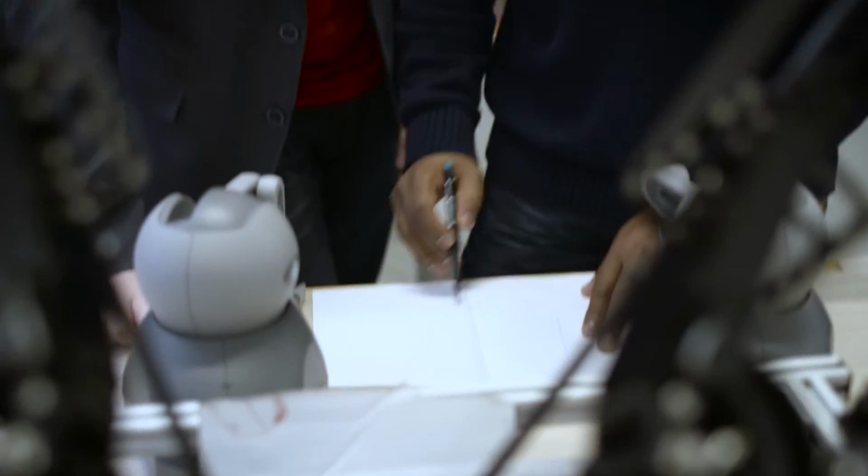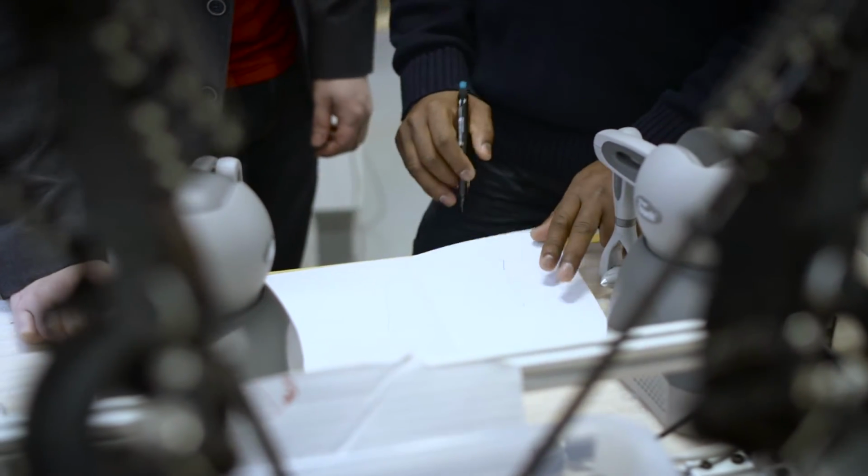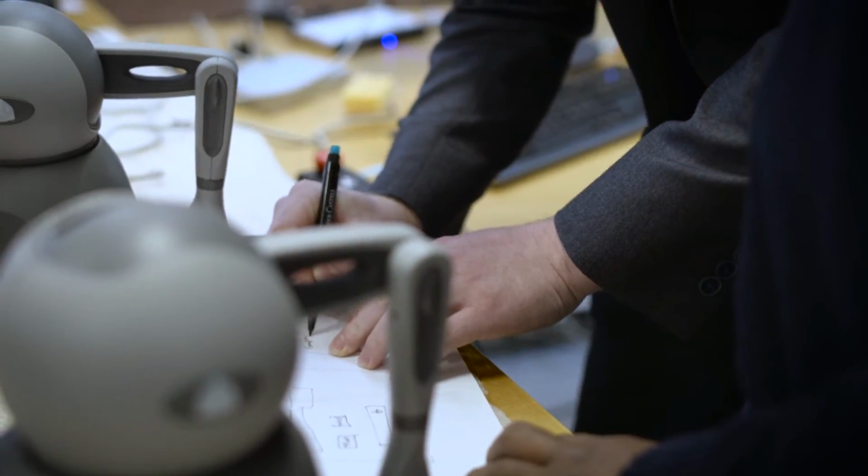Here at our lab, we work on soft tissue modeling. For instance, how does tissue behave when we start to manipulate it? When we start to cut in the patient's tissue, what happens? How does the tissue behave? We need to have good models of this in order to automate these processes.